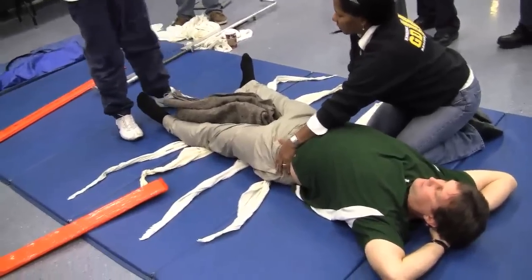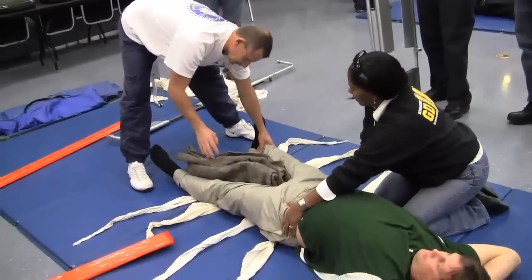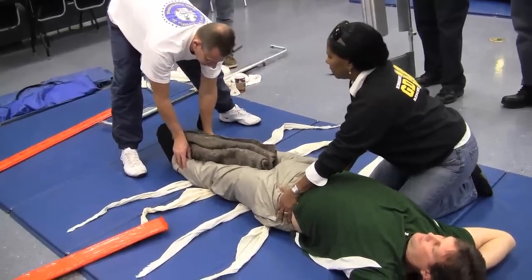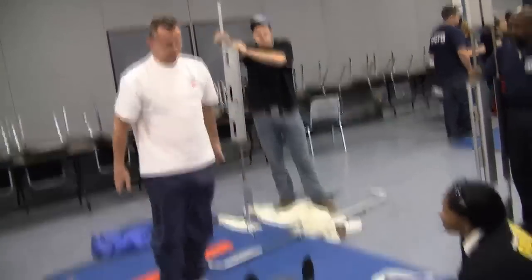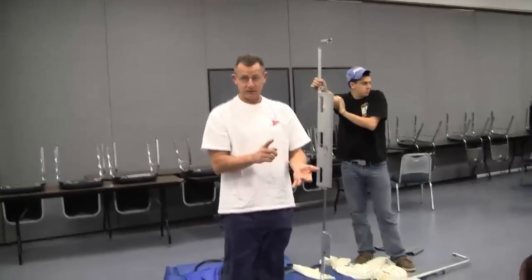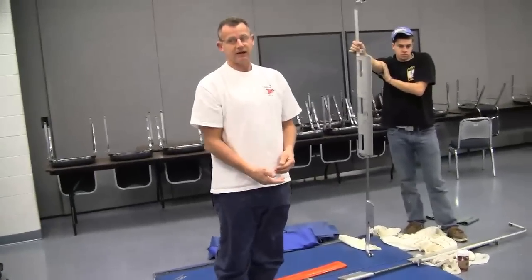So we'll just say it's his left hip that's broken. We can take his right and move it in just like so. Now I have it tight. I'm building a blanket — one complete unit, no voids. So, where would I start tying my ties?